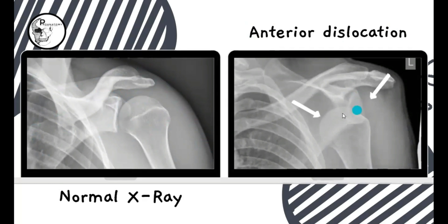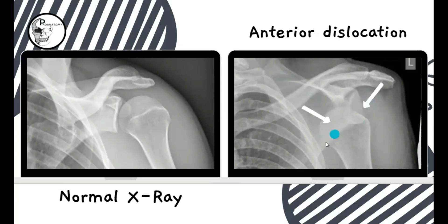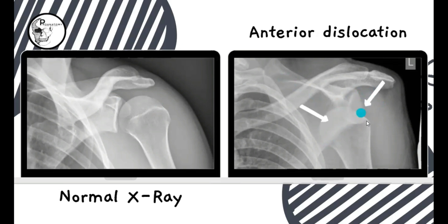On the other hand, in an anterior dislocation, you can see the head of the humerus has been dislodged from its location and displaced anteriorly to the scapula — that is why it is called anterior dislocation. Looking closer, you can find the glenoid cavity margin, and you can clearly see the head of the humerus displaced anteriorly.